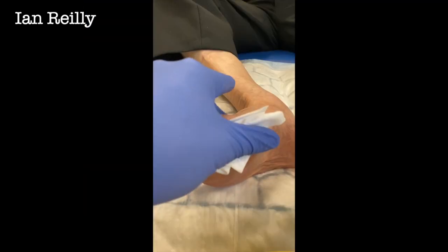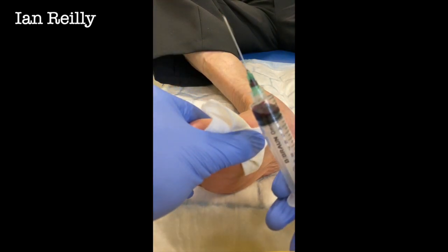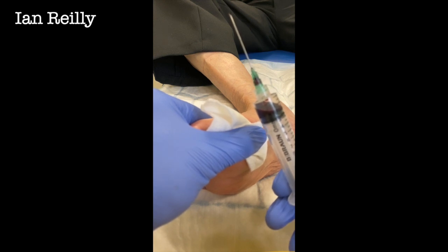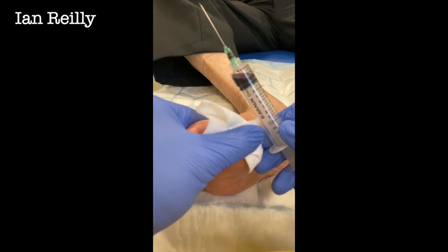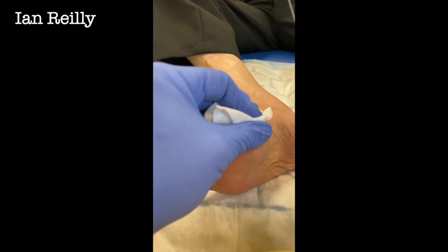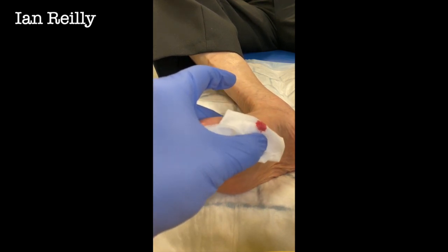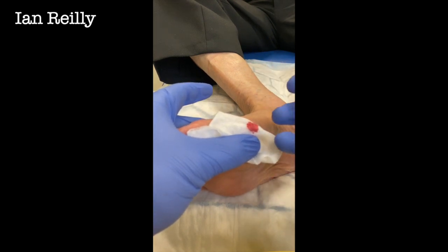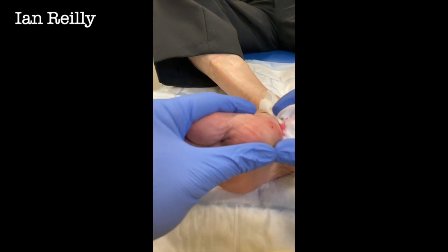That was all blood in there - blood, blood. I don't know if you've been very active of late, I don't know if you've had a busy few days, but that's really quite something. Normally when we take fluid out of a bursa or ganglia it looks a little bit like wallpaper paste, but that's actually reduced the amount of thickness there. I'm going to see if I can drain any more out - just going to get rid of that syringe, see if anything else comes out.